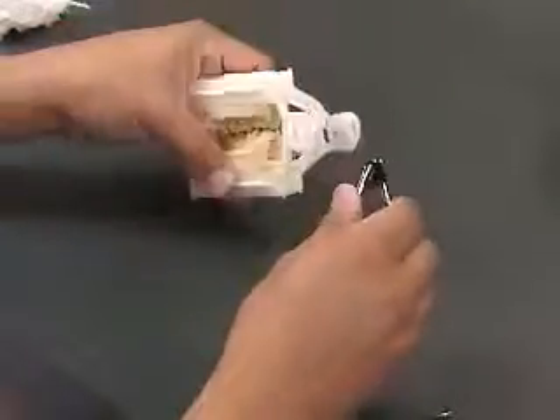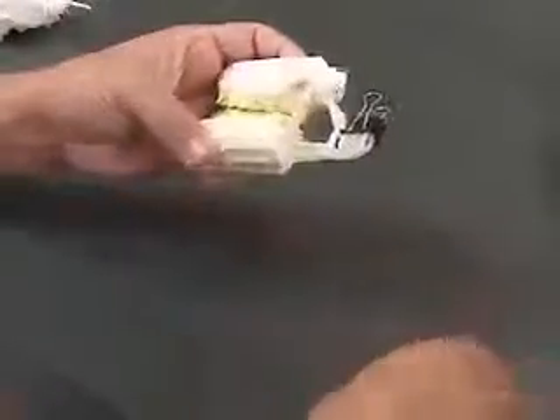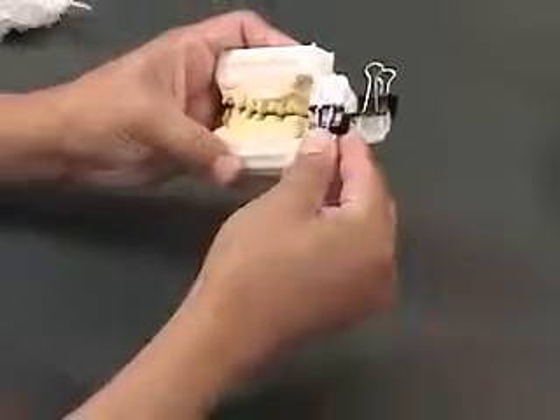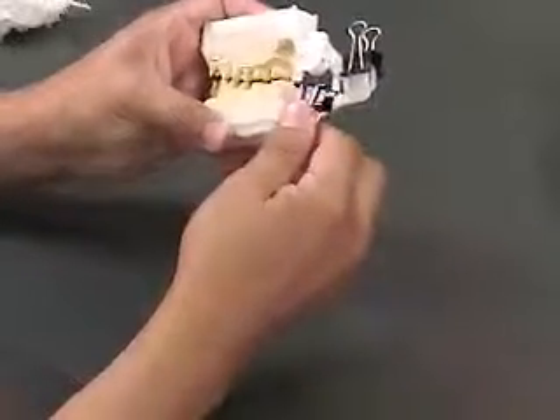Depending on how far off the bite is, you may need to lock the ball and socket to achieve complete centric position when correcting the bite. This can be done using standard binder clips found in any office supply store.